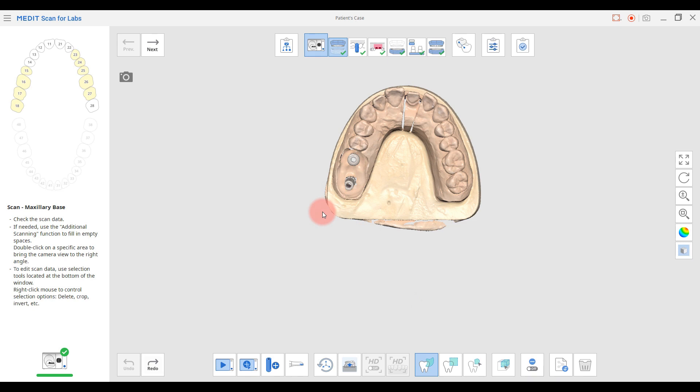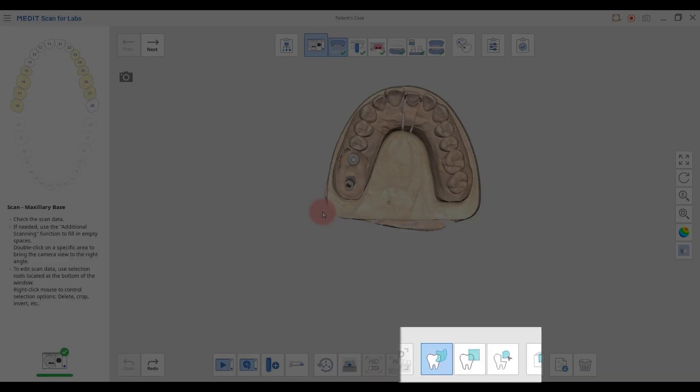We have three types of trimming tools at the bottom and you can pick one of them to proceed.